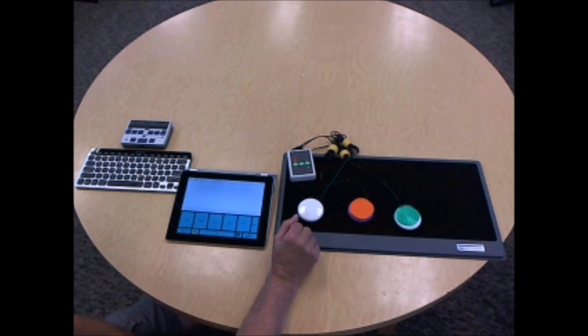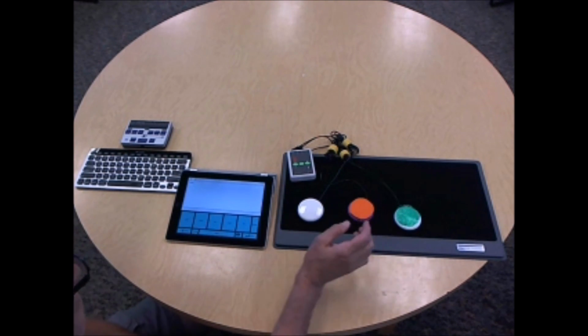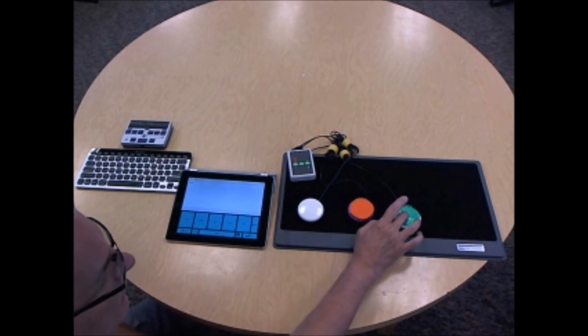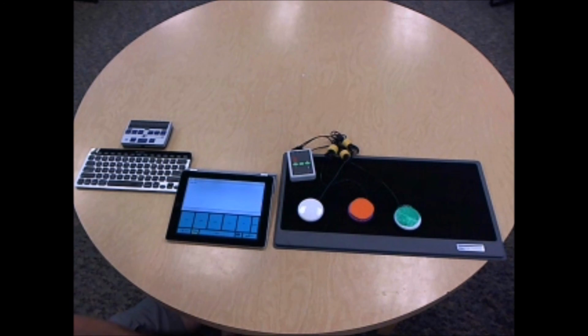I feel. Button. And then I can select. I feel. And then I can pick the sentence ending. I feel happy, sad, angry, silly. Button. And select. Silly period. Okay. Well, that's a brief overview of Switch2Scan. Voiceover capable, incredible device.